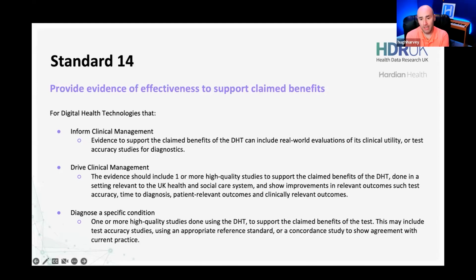For driving clinical management, the NICE framework suggests you should have one or more high-quality studies to support your claimed benefits, done in the UK. So if you're an international manufacturer, it's not enough to show that it works on American or Spanish patients. You have to show it works within the UK healthcare system, and show that the improvements in those relevant outcomes, such as your accuracy, your time to diagnosis, or other outcomes, are all measured appropriately. And you might not do that in one study, you can do that in multiple studies.